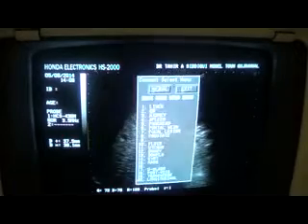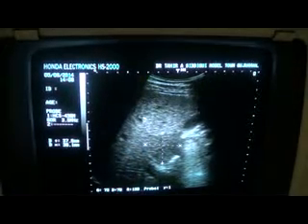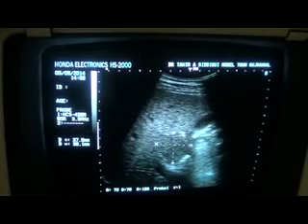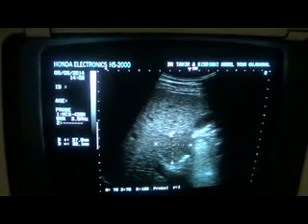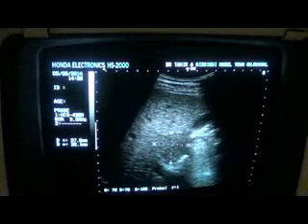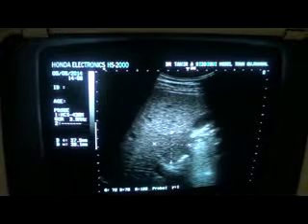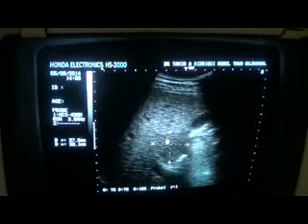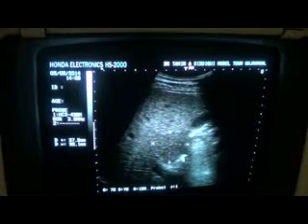Now you can see that all of this is fatty liver. This is the portal vein, this is the gallbladder, and these are the bowel gases. This is the area where fat deposition is not seen — and this is not a mass. This is an area of focal fat sparing.